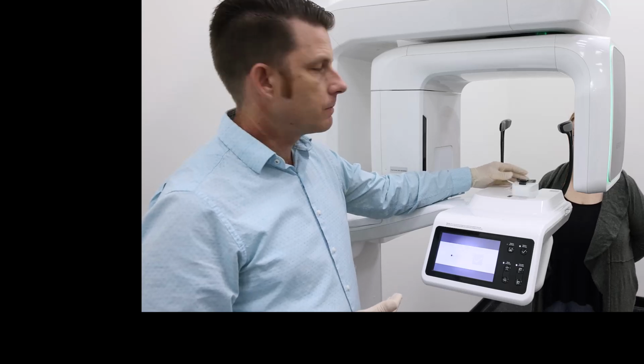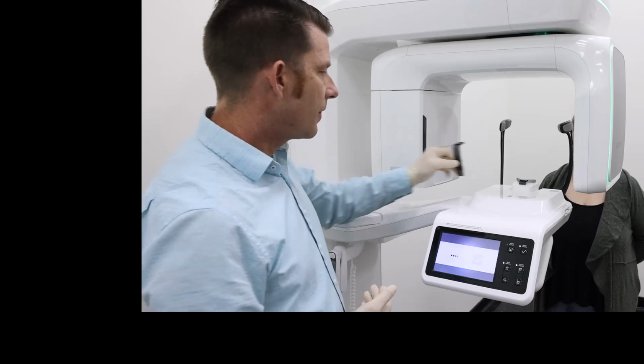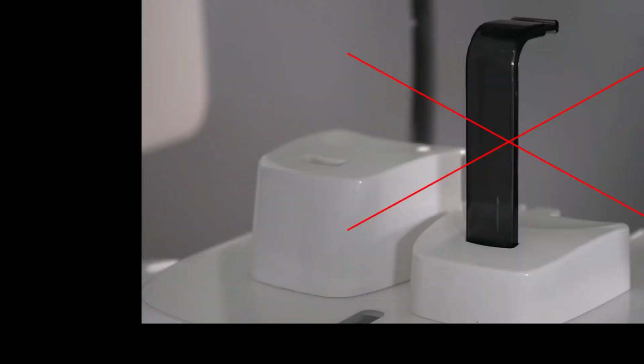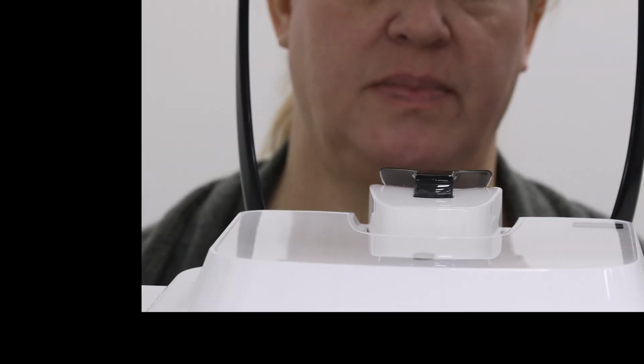So let's talk about utilizing our lower chin rest. In this case, I've installed the edentulous cup. Note that the regular bite stick cannot be used with the shorter chin rest. So let's go ahead and bring our patient back in. So go ahead and step into the device.